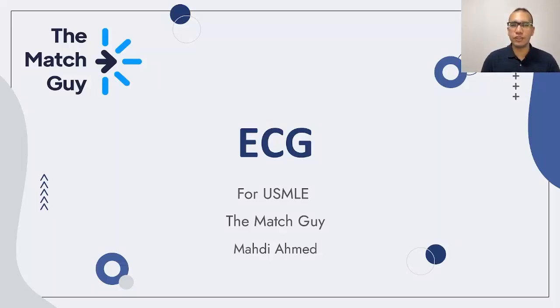ECGs look scary at first, but they don't have to. By the end of this video, you will feel much more confident approaching ECG questions in the future.